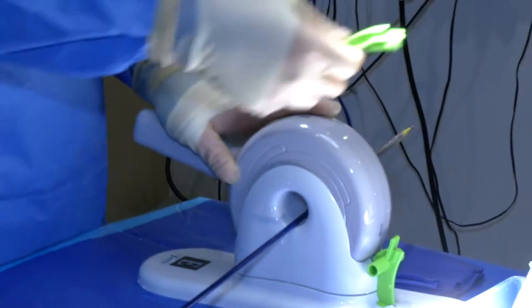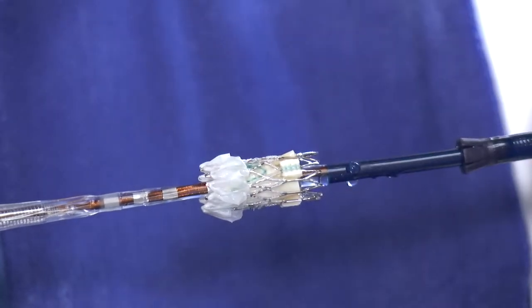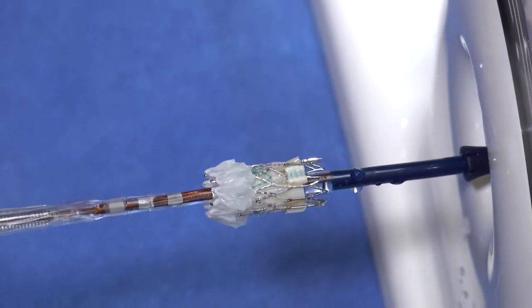And then what we'll do is we take this piece off, and that'll allow us to go down to the final crimp when we're ready and he's crossed the valve and we're ready to put it in.